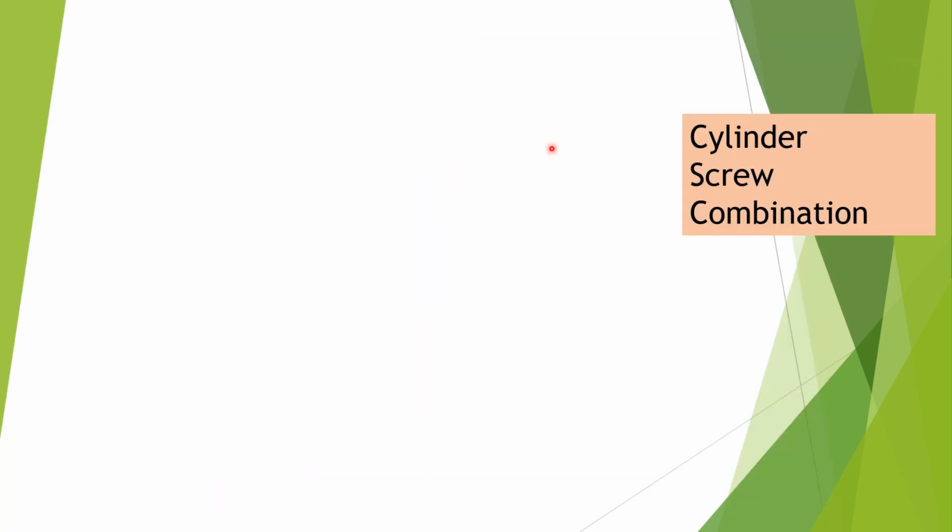And there are three primary types of root form endosteal implants based on design. They are cylinder, screw, combination. So these are the three major types of root form body implants.